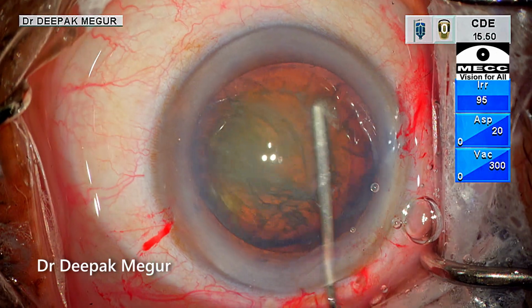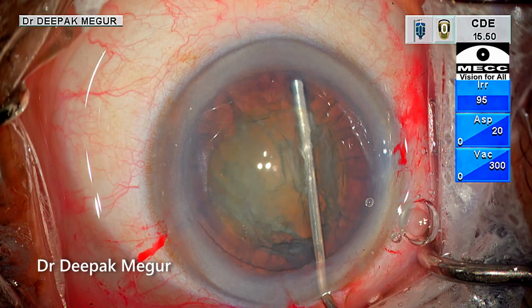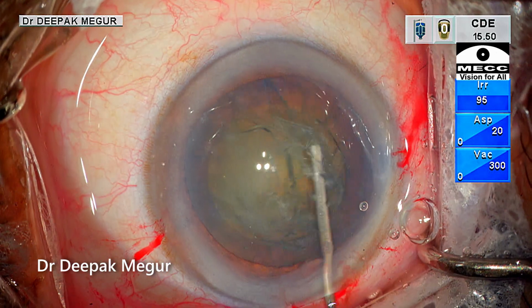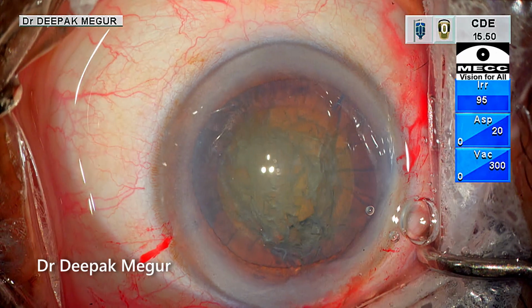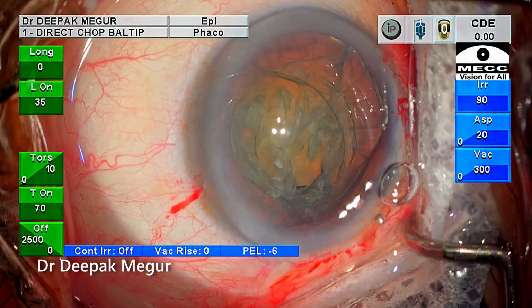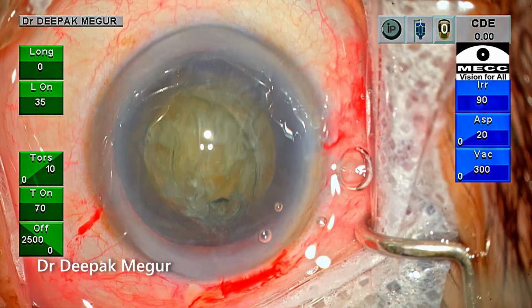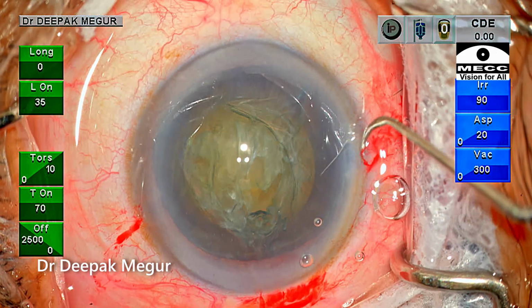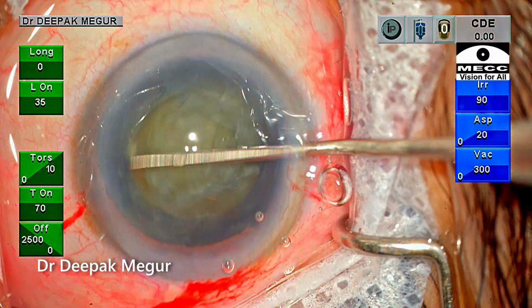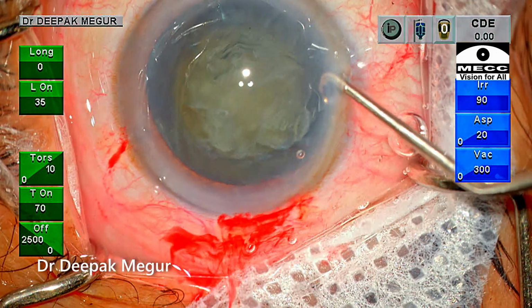When I'm planning to do a horizontal chop, I usually want to do the hydrodelineation simply because we have an extra layer of cushion in the form of the epinucleus, because the chopper is going to go to the periphery and it just gives a little bit of a cushion. So when I'm planning to do a horizontal chop, I invariably ensure that I have done a hydrodelineation and I have a ring of epinucleus which is protecting the posterior capsule from accidental trauma because of the chopper. So this is a Chang chopper which is very long and has a finger-like curve. This design is extremely beneficial because we would want to hook the equator of the nucleus.